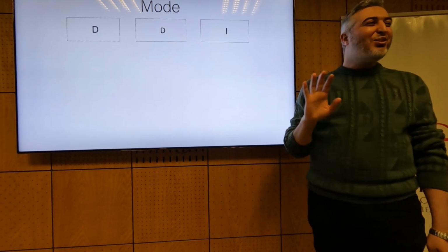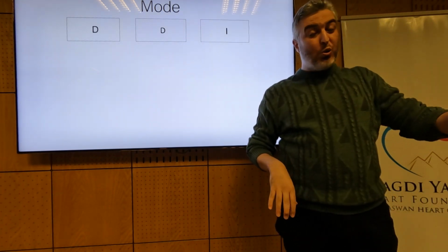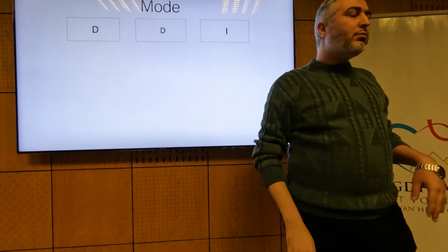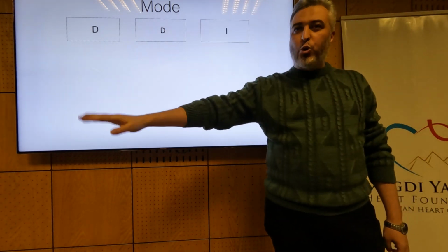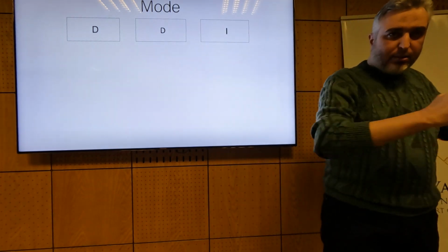Okay. So we've been talking about atrial pacing, AAI, AOO. What's the use of AOO? Same as VOO, okay? So AAI, AOO, VVI, VOO, which are single chamber pacing, atrial or ventricular.